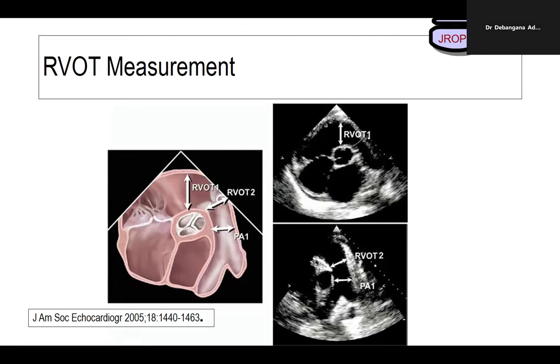Okay, correct, sir. So in ischemic and valvular conditions like MS, my LA would be dilated. MR, LA would be dilated. So in all these conditions, when we have an established lesion, my LA is dilated and my LA volumes are high. But I'm talking about people who are asymptomatic, hypertensive and diabetics.